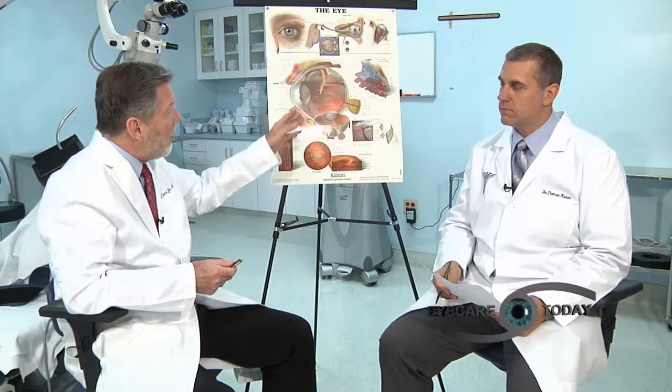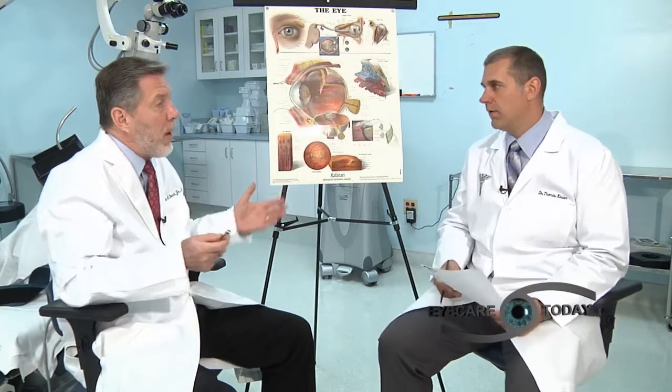Right. And then patients are great, both eyes. Yeah, my patients have full activity in one day. Most surgeons, it's 1 week, no bending and lifting. I use a 3-stepped wound, and it has a self-sealing valve. It's only 1/8 of an inch wide, and it self-seals in a day. And I say, why should a patient limit themselves when we've tested that the eye is equally strong the day after as before the surgery, so they're ready to go. And that's great. Patients want to get back to their daily activities.